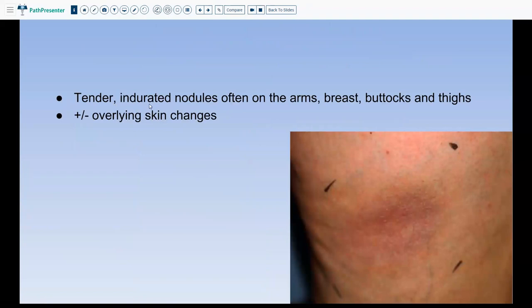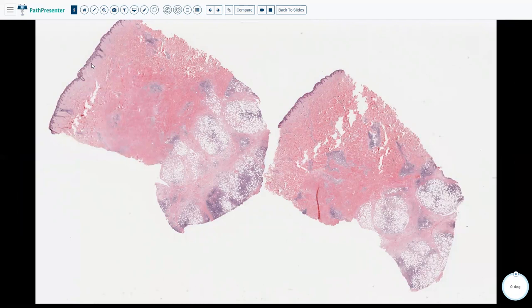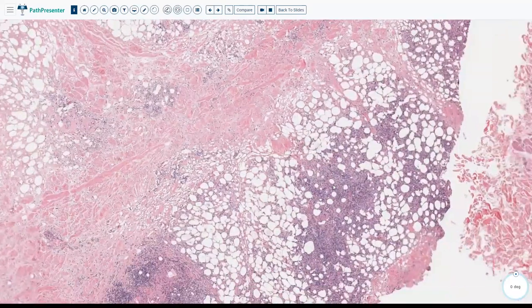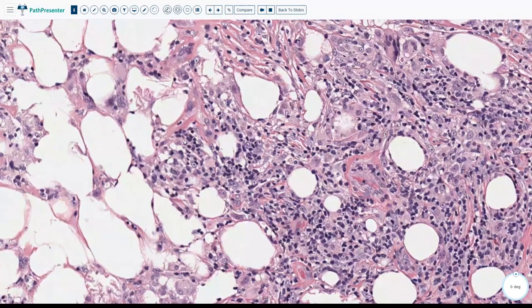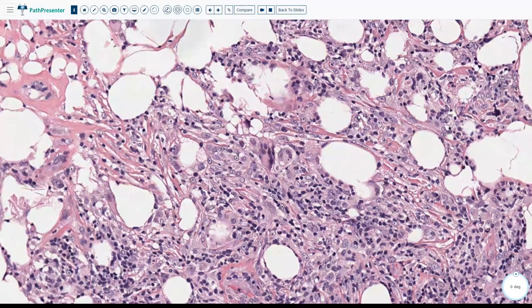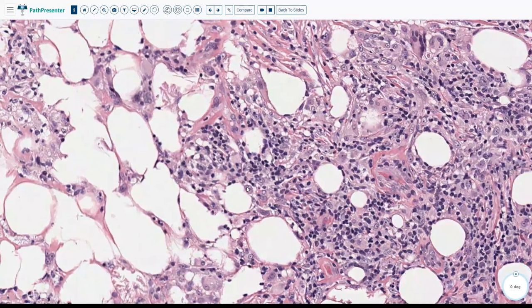Here is a case presenting with tender indurated nodules on the arm, breast, buttock, and thigh with some overlying skin changes. On biopsy, the main action is in the subcutis — the epidermis and dermis are fairly normal with only some mild perivascular and periadnexal inflammation in the dermis. Going high power into the fat, you see predominantly a lot of lymphocytes with associated plasma cells — a lymphoplasmacytic infiltrate affecting the lobules.